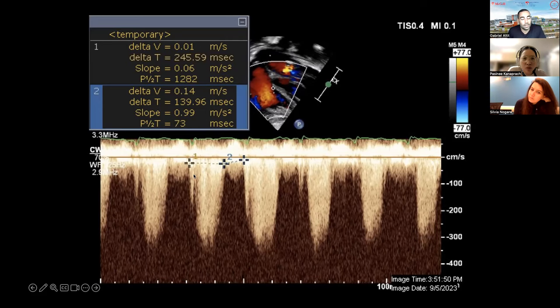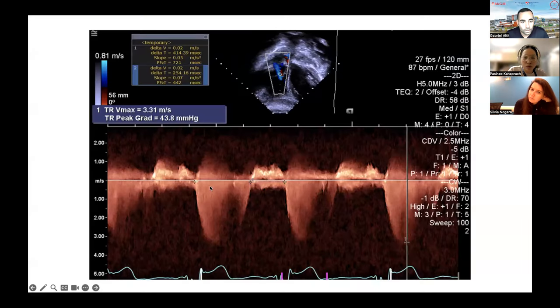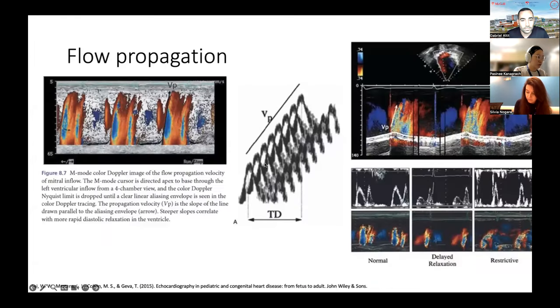There's a publication in the BPD population to follow patients who have RV compromise in the context of pulmonary hypertension. It's a marker that can be used. It's also something we're going to be using and measuring in our research project population with pulmonary hypertension. So again, you're measuring the systolic time duration, the diastolic time duration, and you can do the ratio.